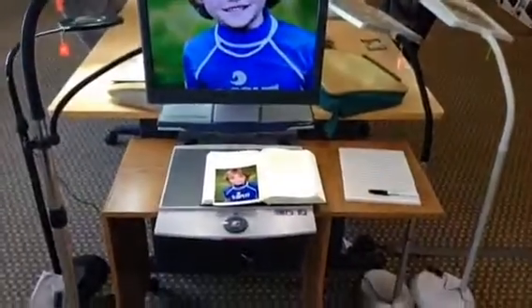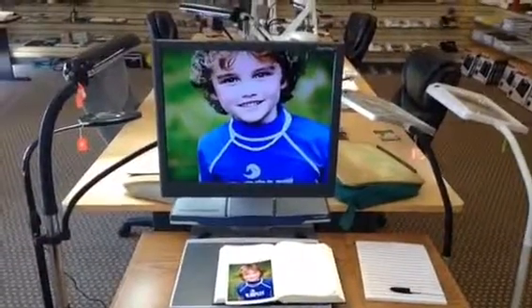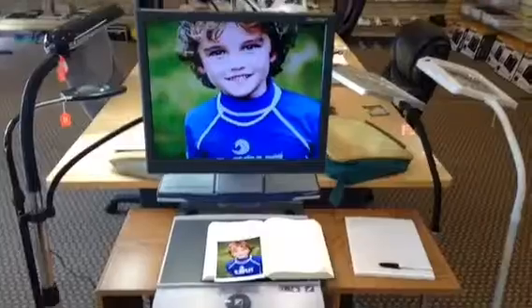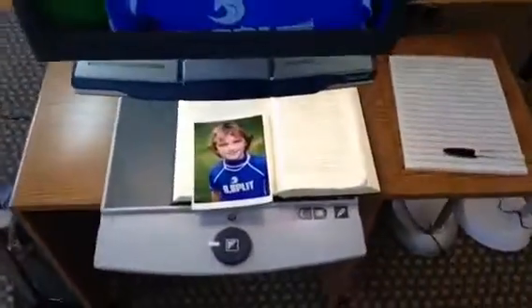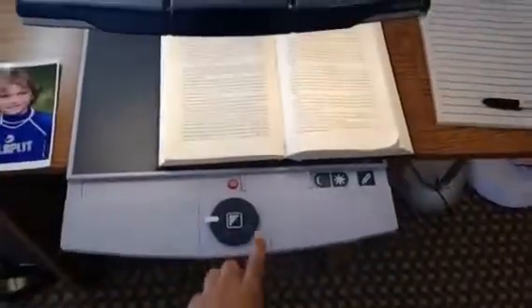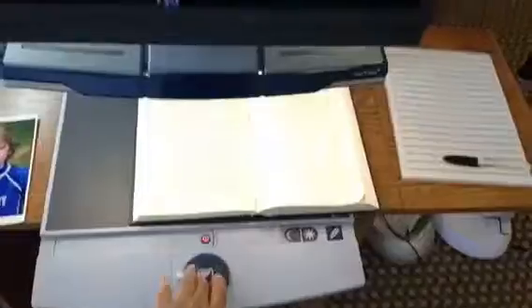This is a video demonstration for our Optelec Clearview Plus 19 inch HD video magnifier. As you see, we have it now in full color mode. We can switch our options with the center button to pure black and white, negative image, and back to natural color.